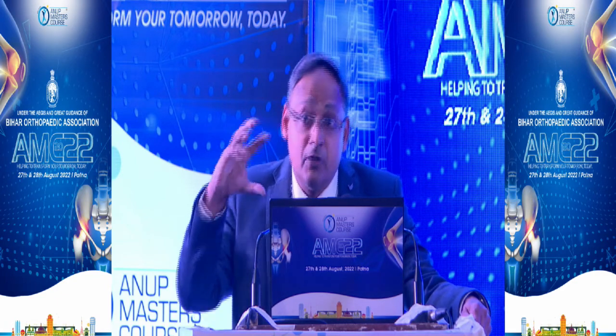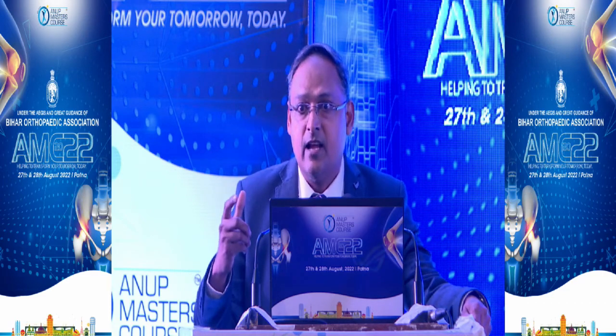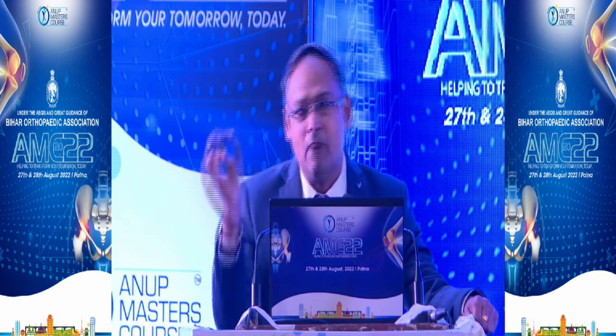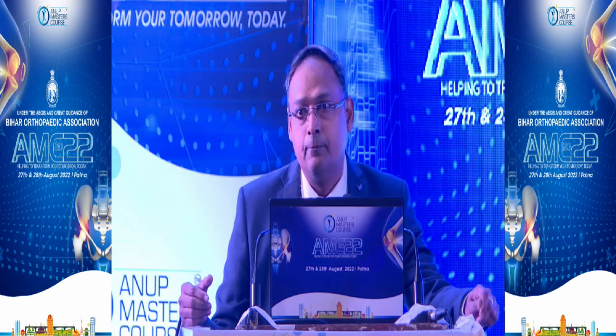More important, especially when you are dealing with the posterior femoral condyle, the stress forces are immense. In that scenario, if you have a wedge which is totally fixed with the implant, that gives better stability as compared to a bone graft, which may or may not absorb properly. That means it may not unite properly, and you need to fix it properly also. There are concerns that cement can go inside the bone graft if you have not adequately fixed and well compressed it. Some amount of cement might enter it, and that may be a hindrance to bone incorporation. Thank you.